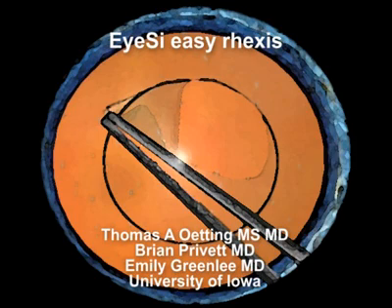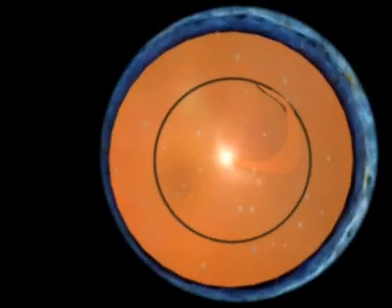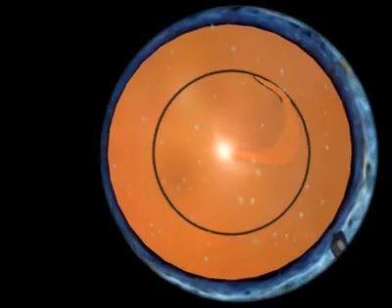I'm going to show you a Rhexis that I recently did on our EyeSi simulator for eye surgery, which is from VR Magic. You can see that we're getting our focus just right, getting our view just right with magnification changes, which have a foot pedal very similar to that of a Zeiss microscope.